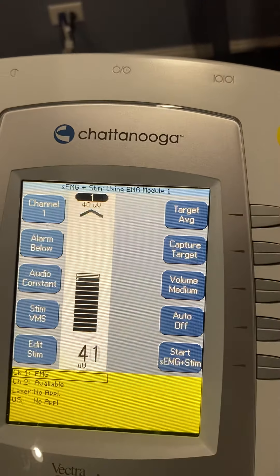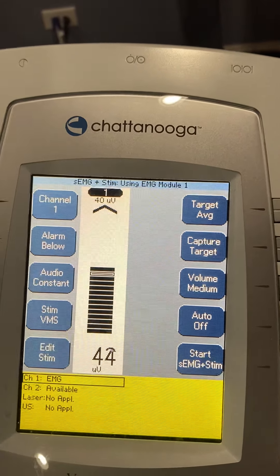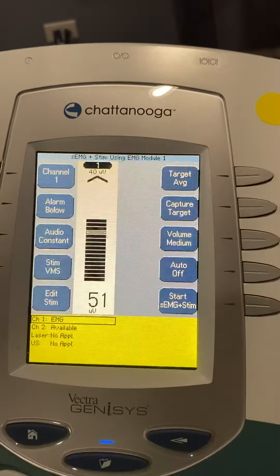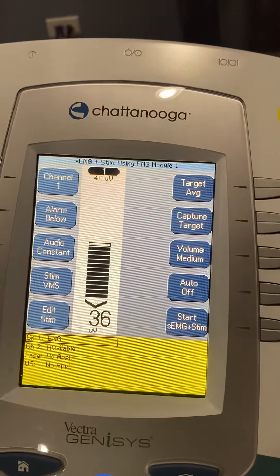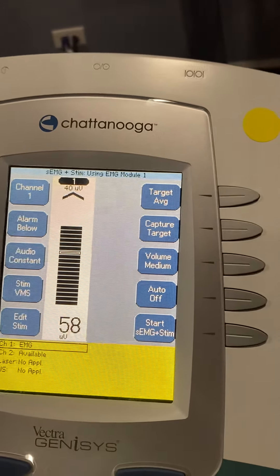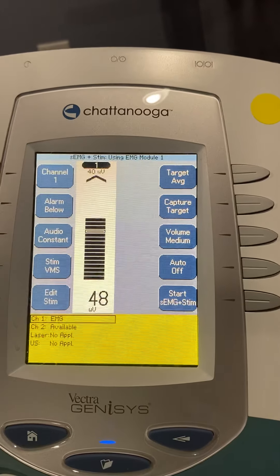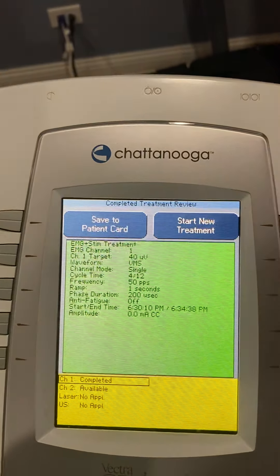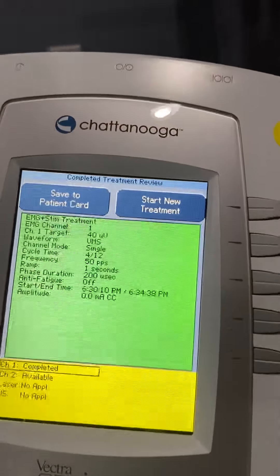I can change it to alarm below. In a busy clinic, I might just want the patient to know when they didn't do very well — contract hard as you can — and that makes it nice and quiet when they succeed. So it becomes like a 'you did bad' alarm. Now let's stop this — that was for strengthening.